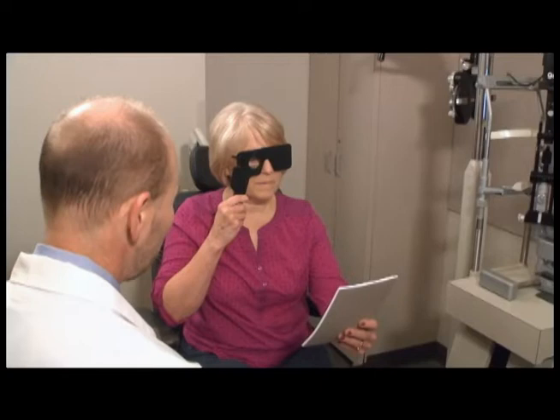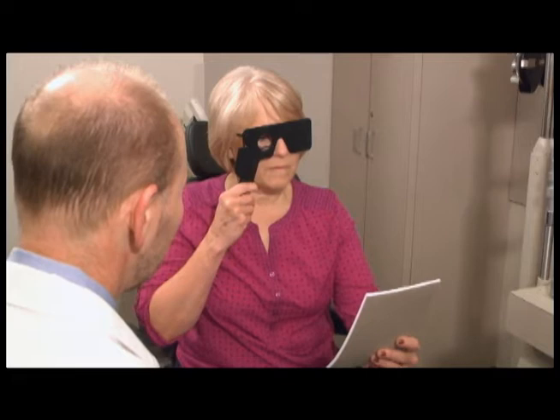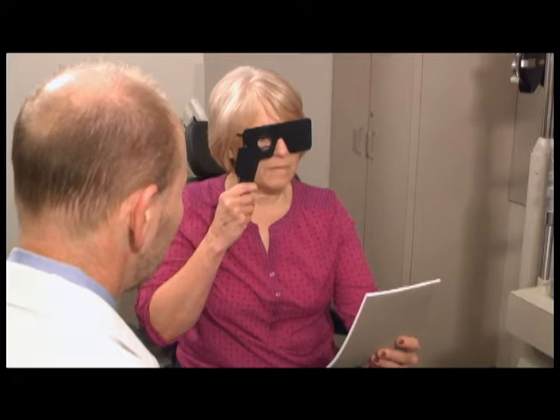Amsler Grid Testing examines the central 20 degrees of the visual field. The patient is instructed to look at the black dot in the center of the grid. The patient should wear their glasses. Any irregularities in the straight lines around the grid are noted by the patient. Each eye should be tested individually.